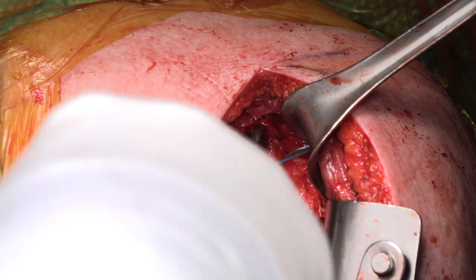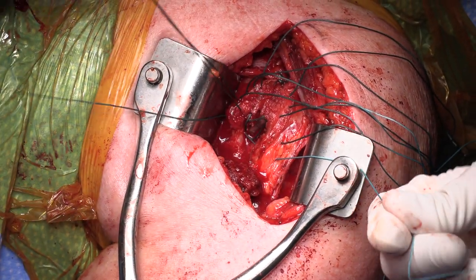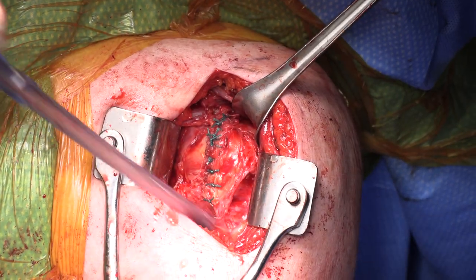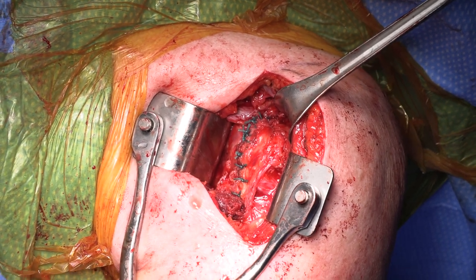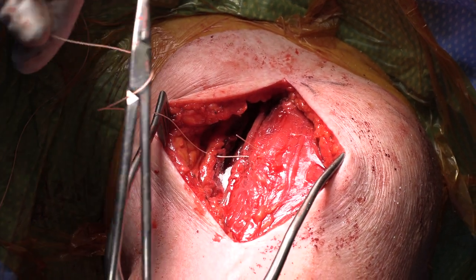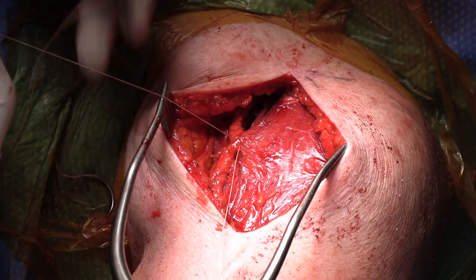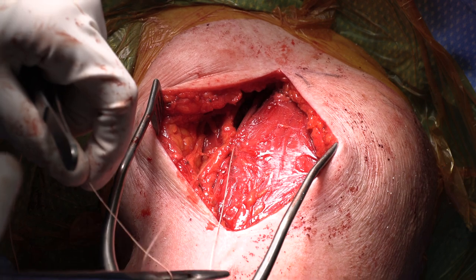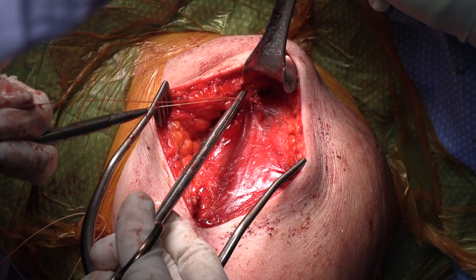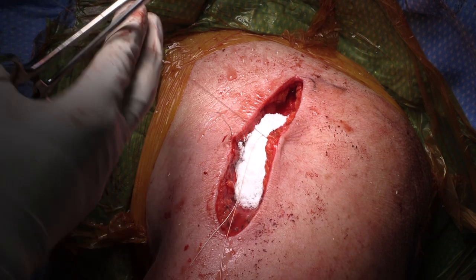The interval repair is performed to decrease the lateral tension on the subscapularis repair. When the repair is completed, external rotation is assessed to confirm the security of the repair and to direct postoperative rehabilitation. One gram of vancomycin powder is placed onto the subscapularis repair. If post-surgical bleeding is a concern, a drain is placed deep to the deltopectoral interval. The deltopectoral interval is tacked together with number zero absorbable suture in a locking running closure, and a second gram of vancomycin powder is placed on top of the deltopectoral interval repair.